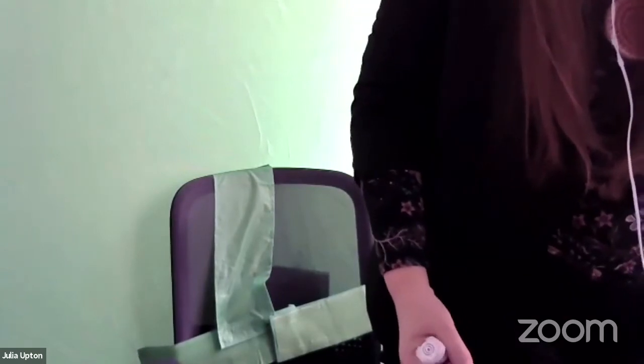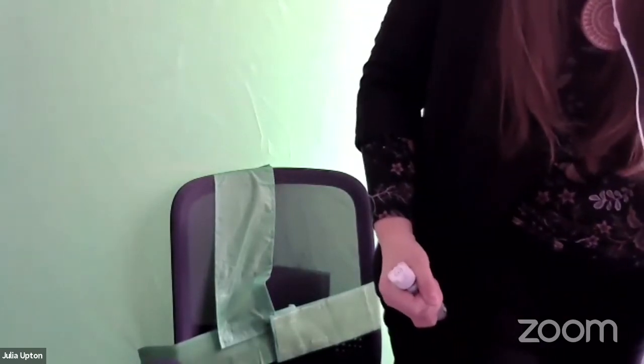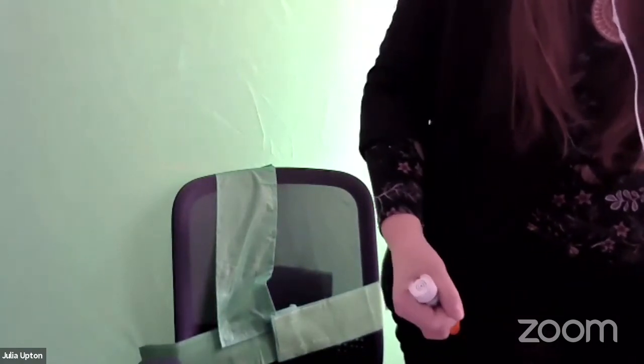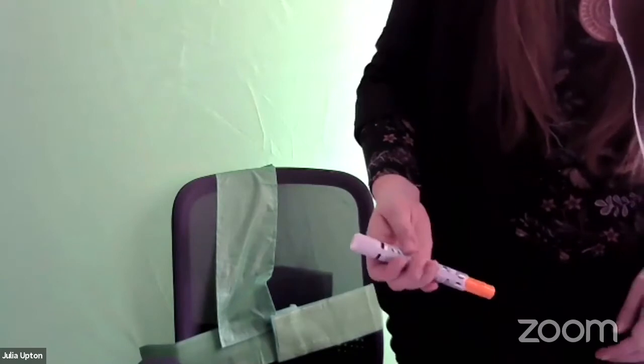And I'm wearing headphones, so you may not have heard the click, but it made a click. And then we count 5, 4, 3, 2, 1, and then you can take it out. So now, sorry, go ahead.